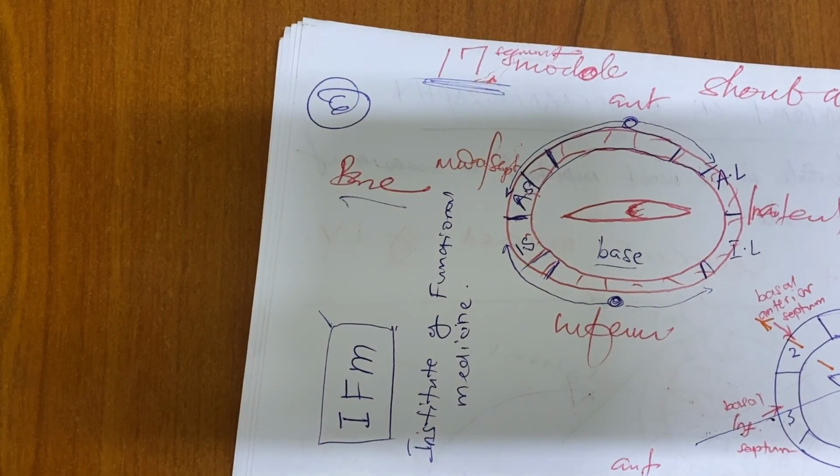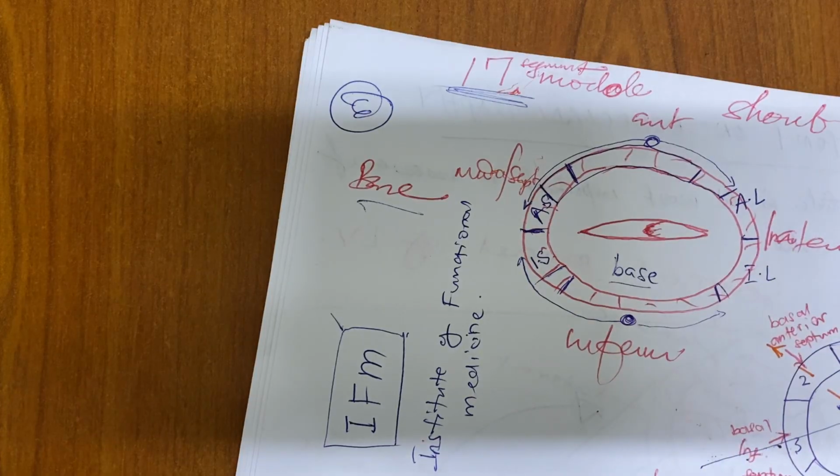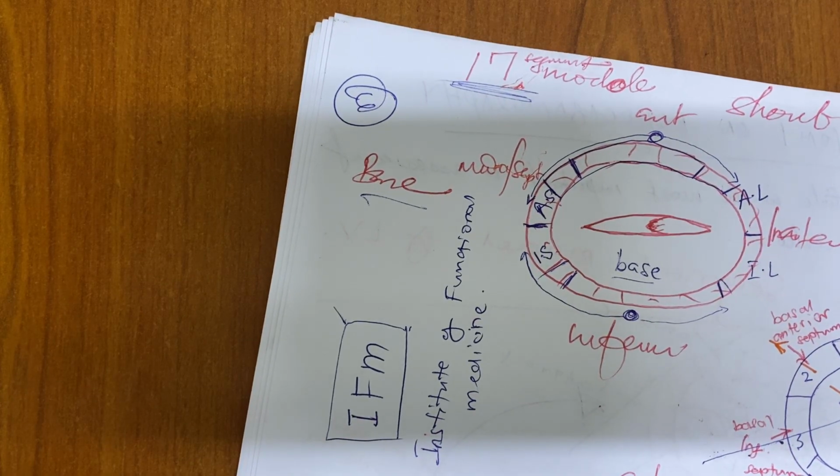Where should the apex be? The apex, where should it be pointing? Like, how would the image orientation be? You try to draw it. It is not in the camera. Try to draw it. Just a small thing. So you can guess how it will look like.